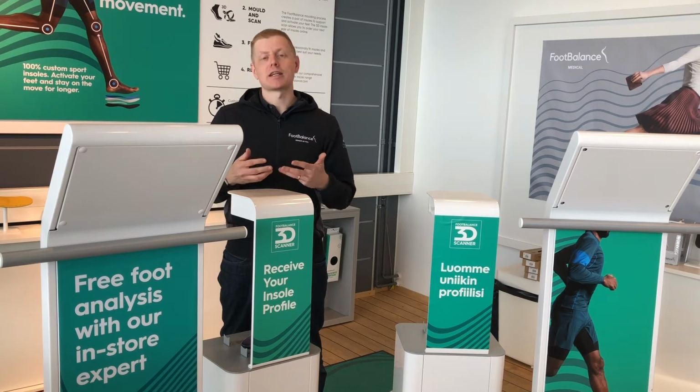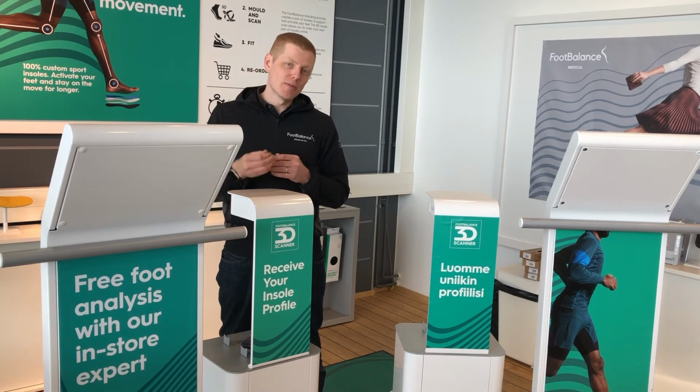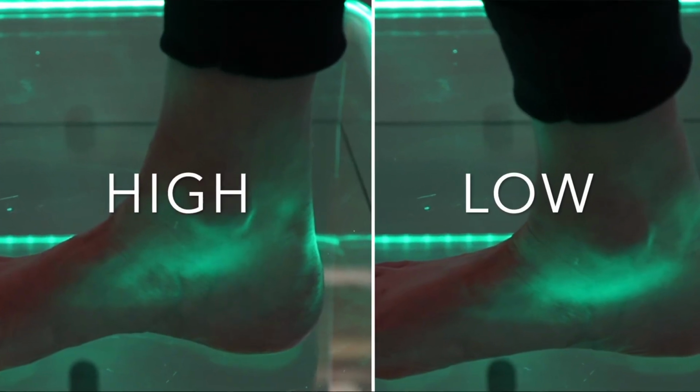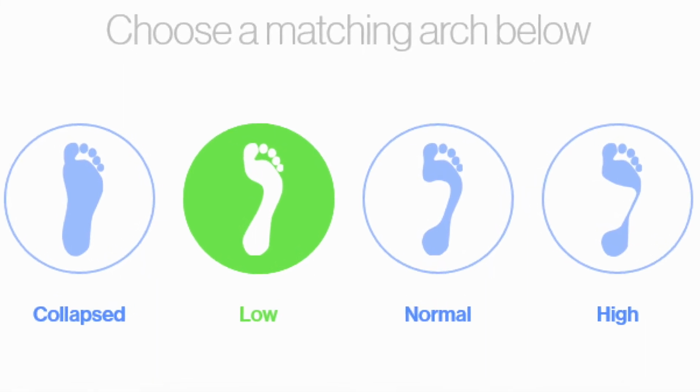Before manual testing, make sure that your customer is comfortable with it. Remember that you can also look at the arches visually as well. After analyzing, select the correct arch type in the software.